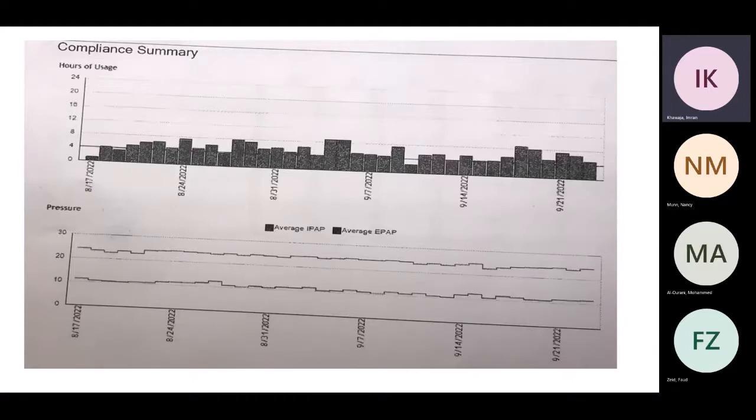Can you say that again? Sorry, Tariq. So I think I'm jumping ahead of myself. That's okay. When I do the other slide, you will know that. So the EPAP or CPAP, or whatever you're going to call it. So this patient is sitting now at 10 and 14 settings, is that right? 10, 14. Ideally, it should be 5 to 15, that's for the EPAP. Correct. It should be 5 to 15, but that's right. The machine, since all it takes to keep the airway open is 10. Okay.